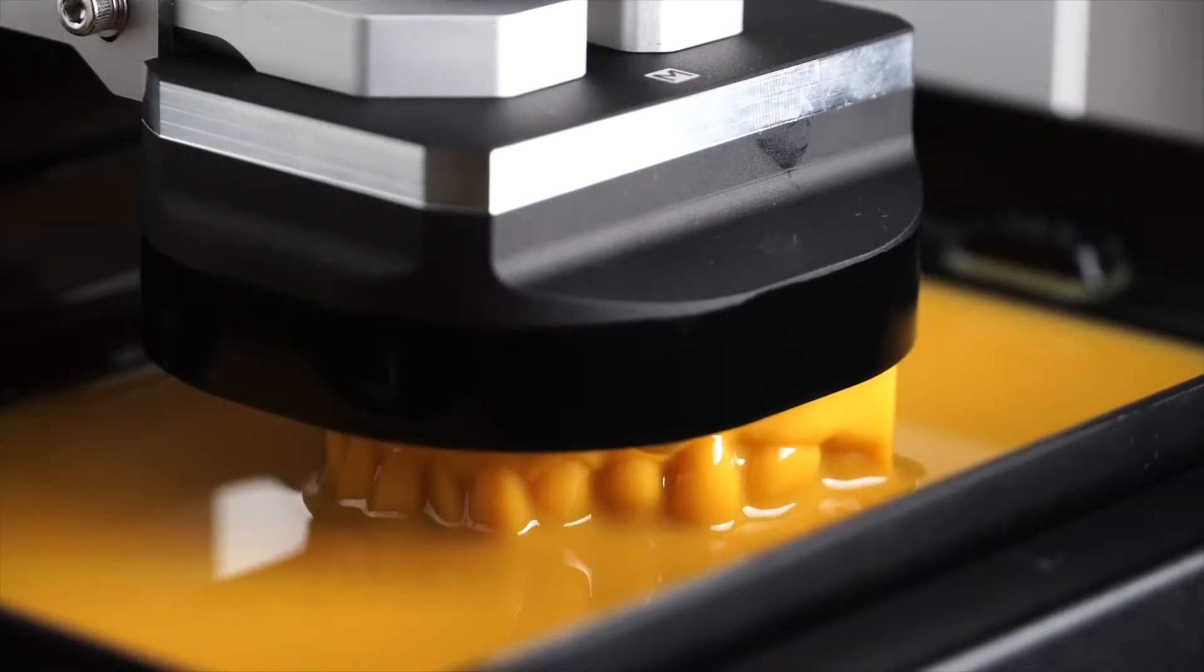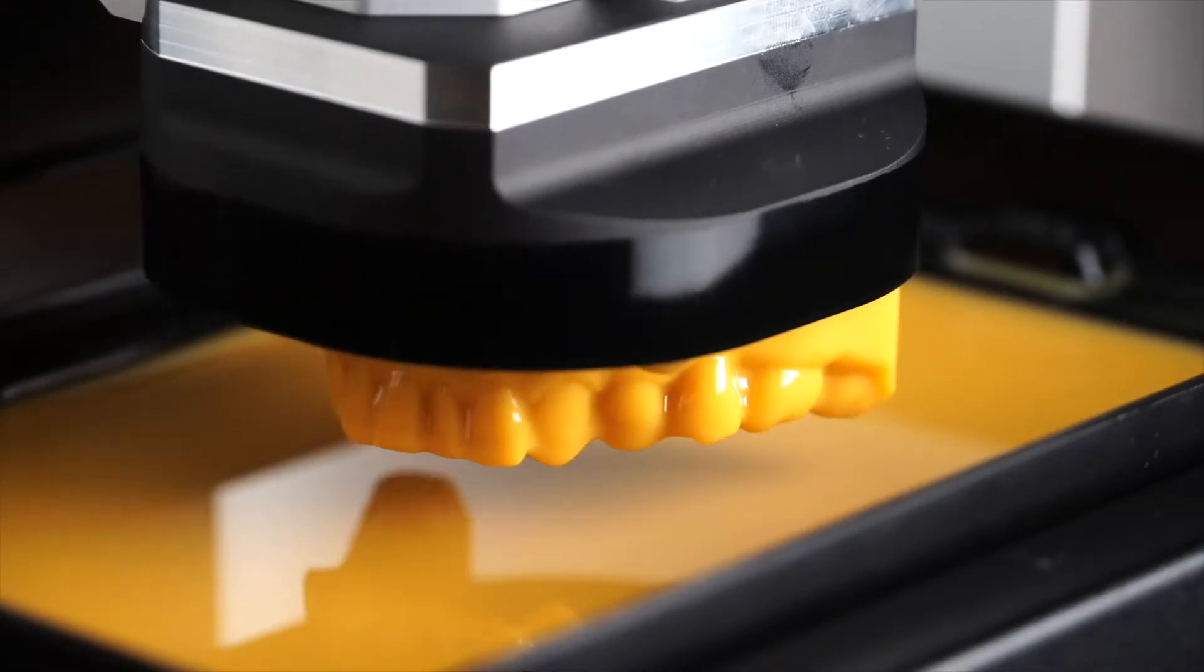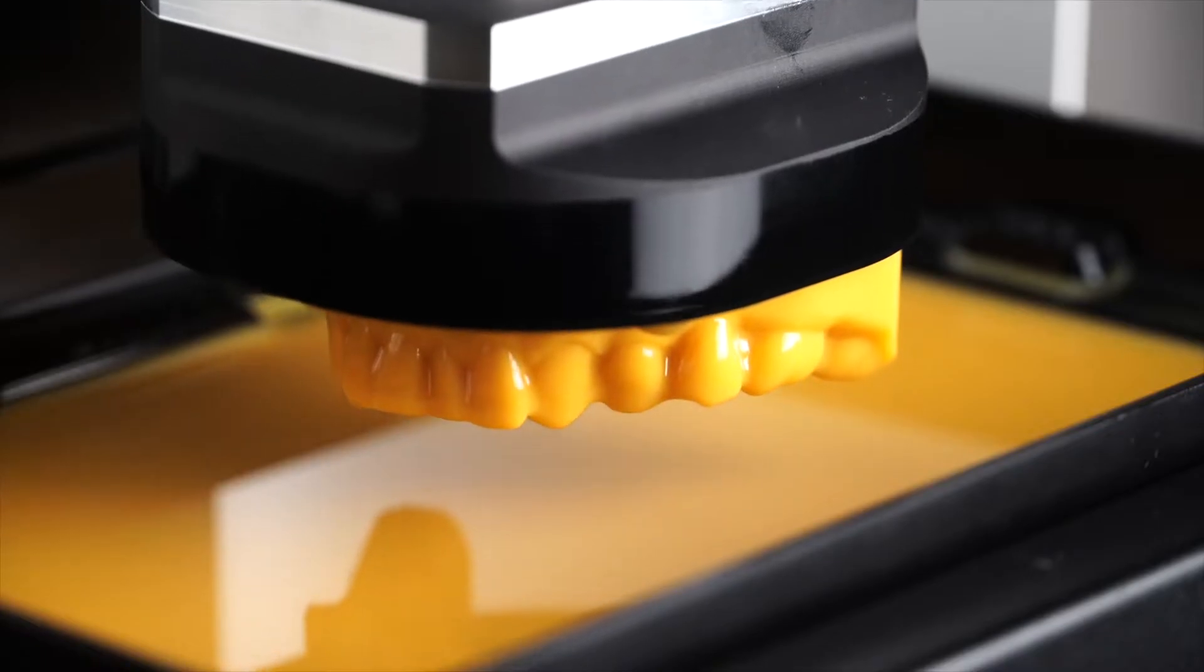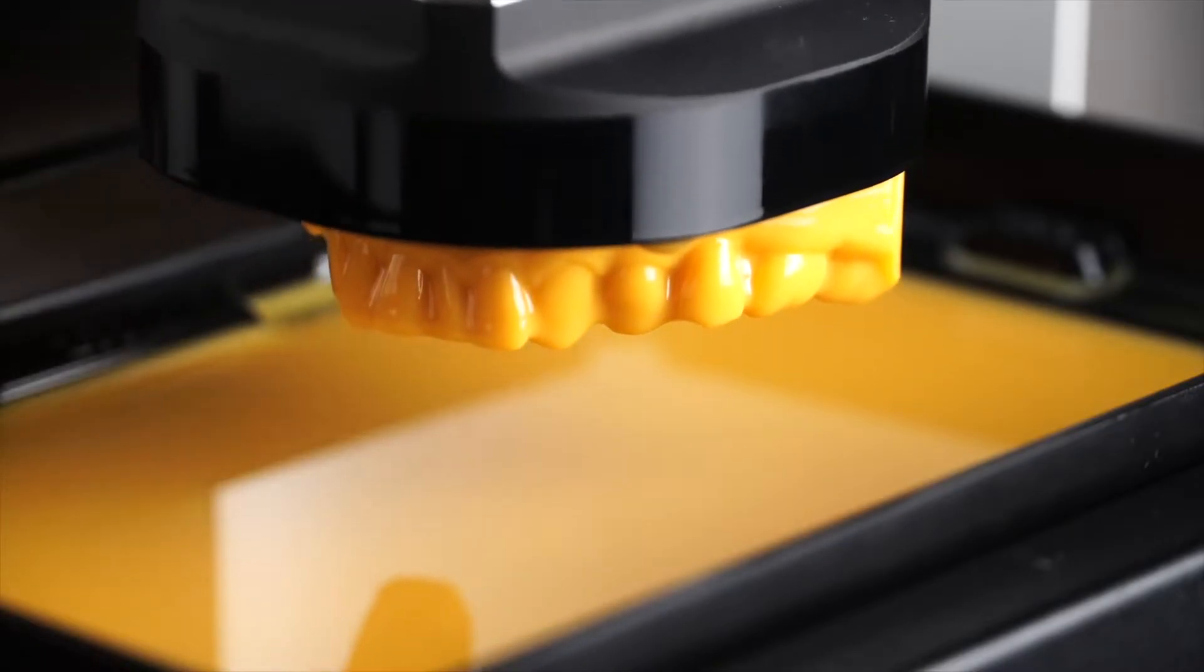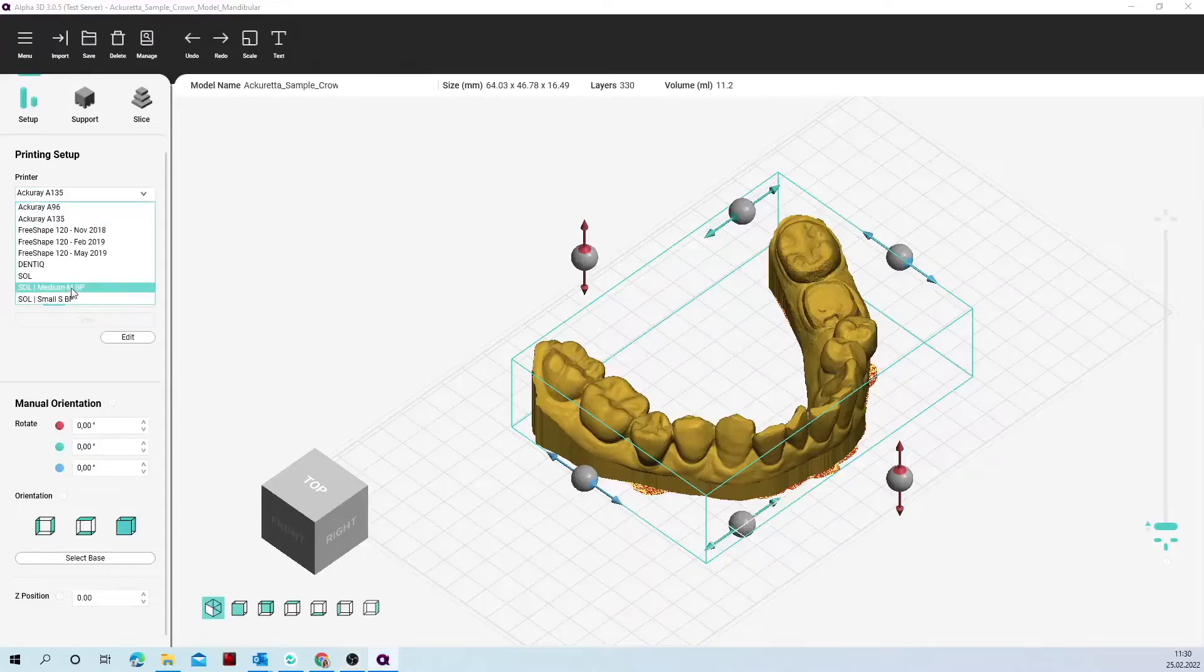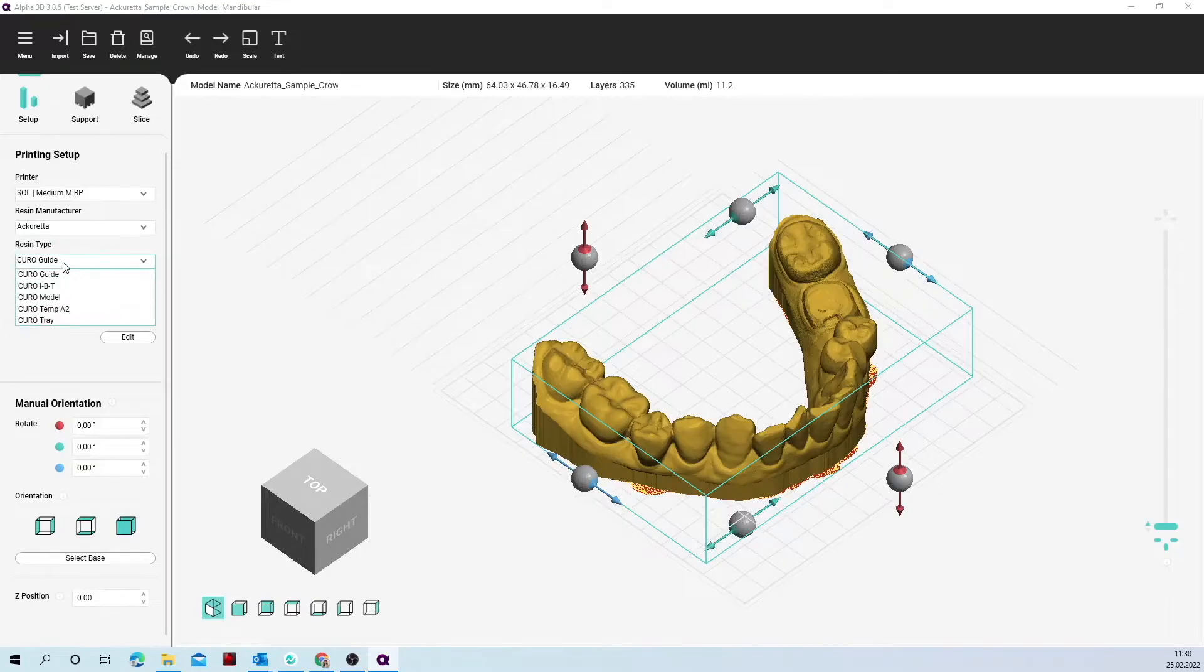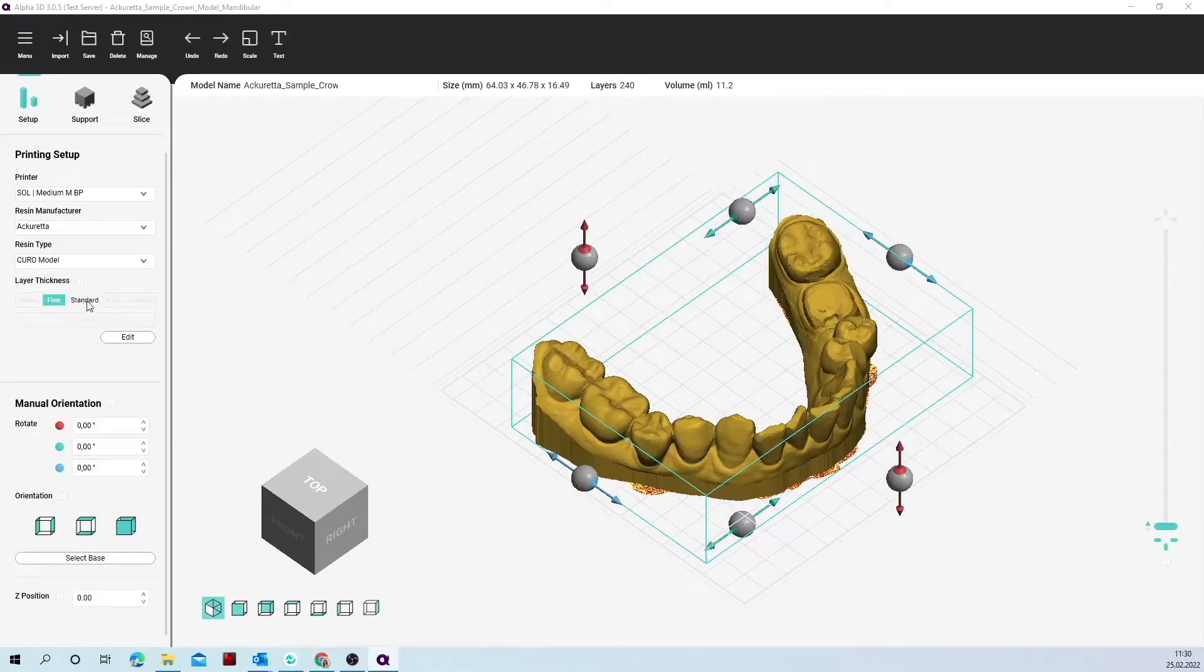Today we'll be showing you the full workflow for a large model that fits perfectly onto the medium build platform. After importing the model, choose the correct platform size on Alpha 3D, which you find in the printer section. Choose the resin you want to work with and then prepare your printer.